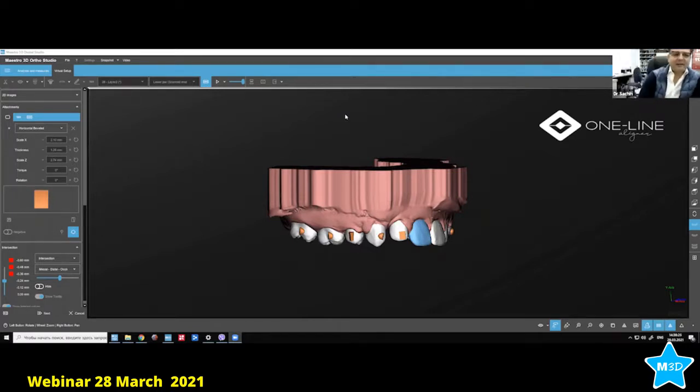But I think, as I said, do the planning first, which is more important, and then plan for the attachment, not the opposite. Okay. So that is going to be your basic for today. Plan the movement first and then the attachment. Right. Anybody with any more questions? At the moment, not. Okay.